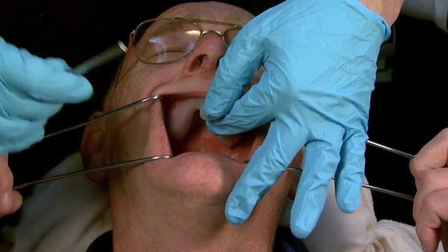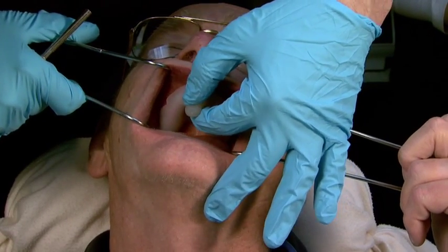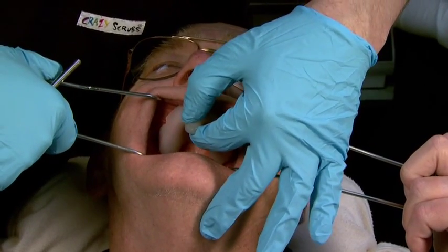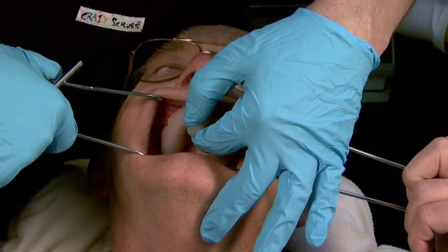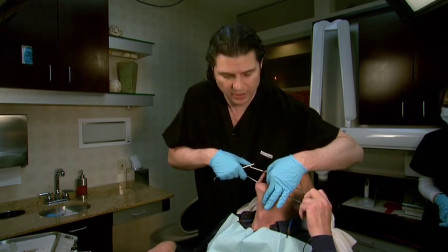I'm going to check the right side. I'm going to grab that retractor. The anterior region is short. The frenum is good and it's a little overextended in the very far distal buccal region around the buccal side of that tuberosity.